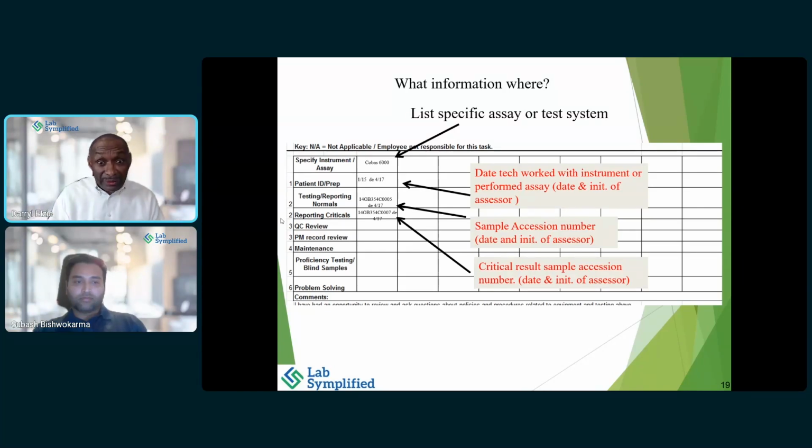Other things you have to take a look at, blood bank, that's another area that gets a little squirrely. There's a lot going on in blood bank. You have to look at that, because usually if there's different sample manipulation or processes, you're going to need to have that as a separate assay. And be prepared, if you do group some together, to talk about why those are in that group. We feel that should be just one assay. We can group them all together.